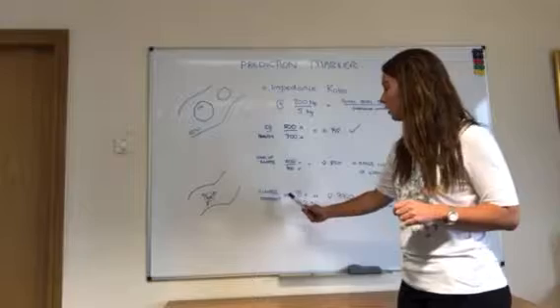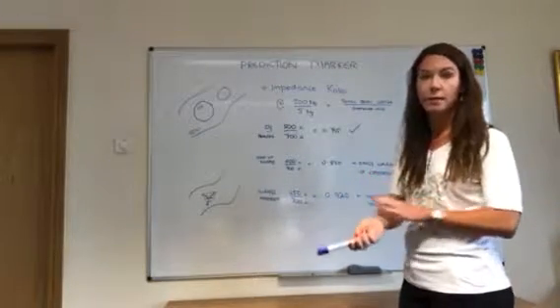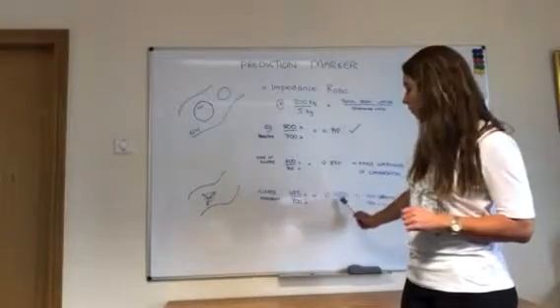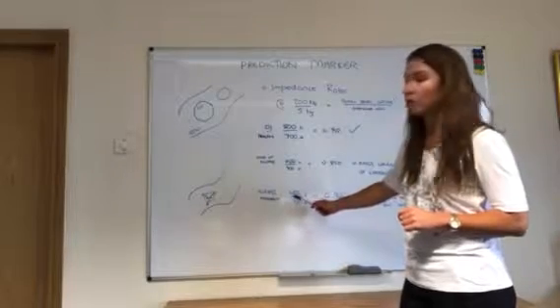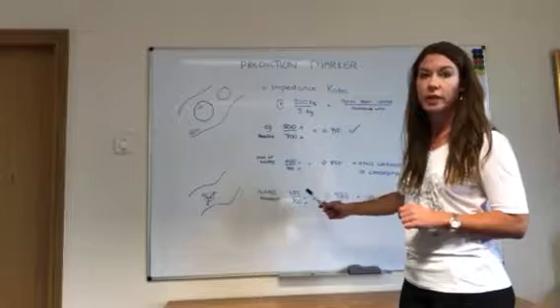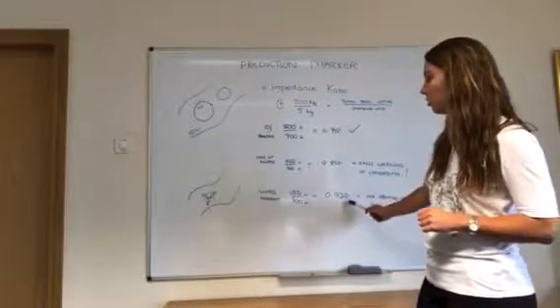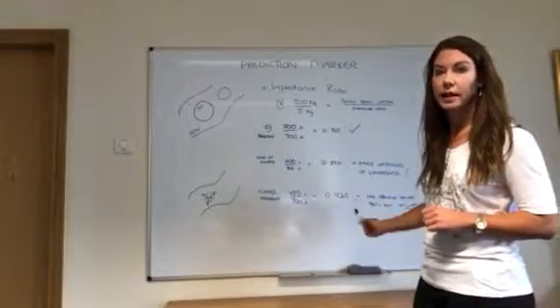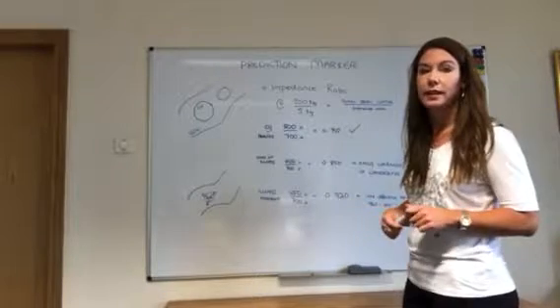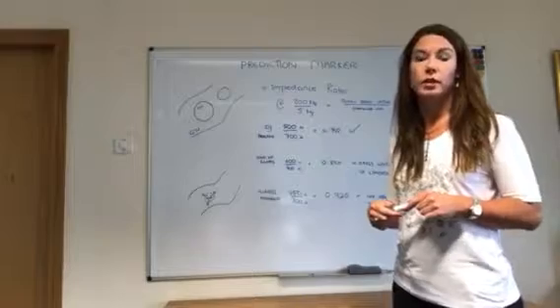When it does become apparent that the patient has lymphedema, that ratio will actually increase. So for example, 650 ohms at 200 kilohertz over 700 is 0.920, which is a serious case. When that prediction marker is above 0.9, that's a serious case and one to be monitoring quite acutely.